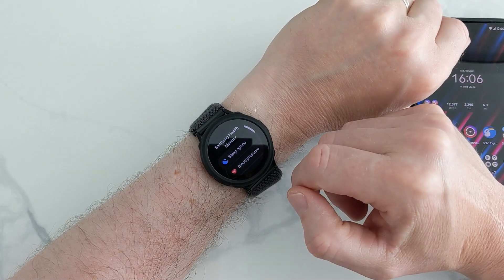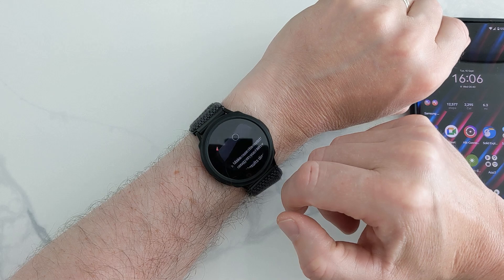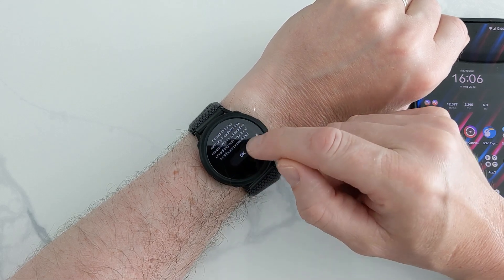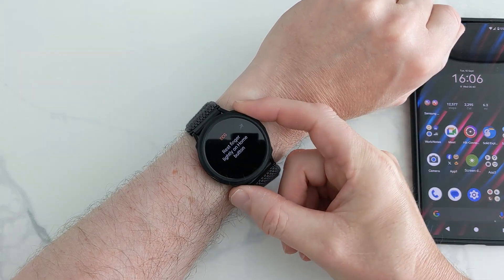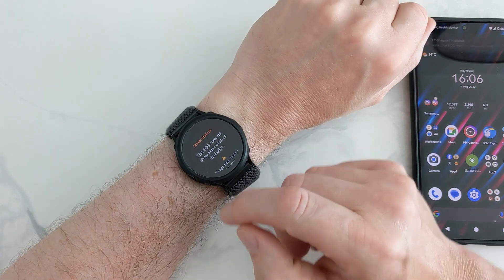Hello. In this video, I'm going to show you how to install the Samsung Health Monitoring app. It's a modded version on your Galaxy Watch, but also working on a non-Samsung phone.